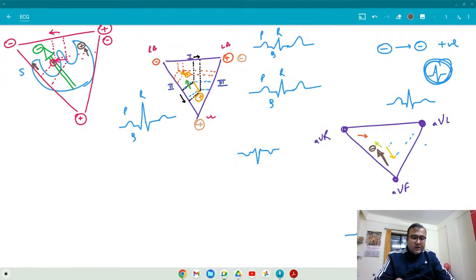Look, okay, let's once again keep it simple. Wherever you are having two electrodes, use of two electrodes, bipolar. Where you are having basically one electrode, unipolar. Simple.